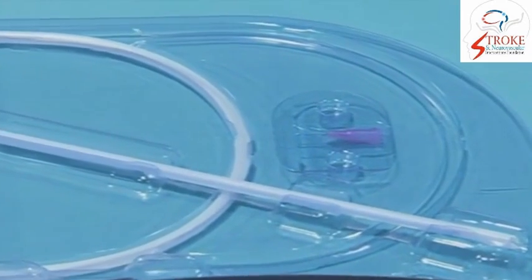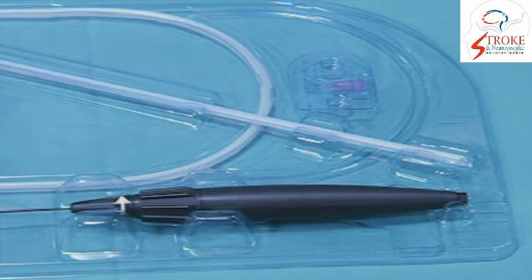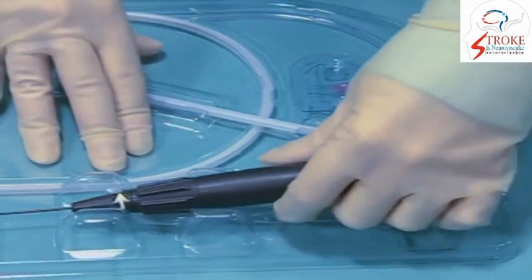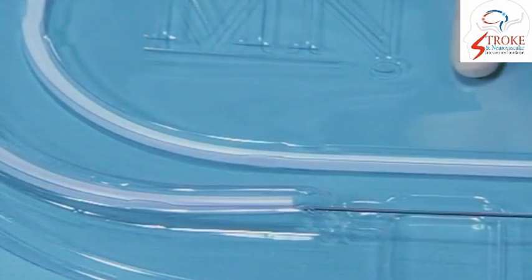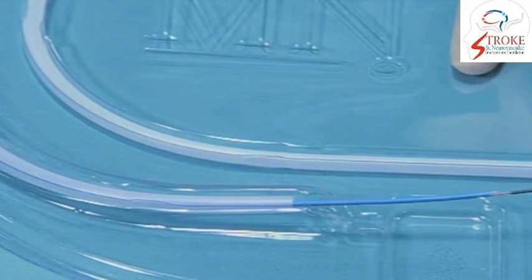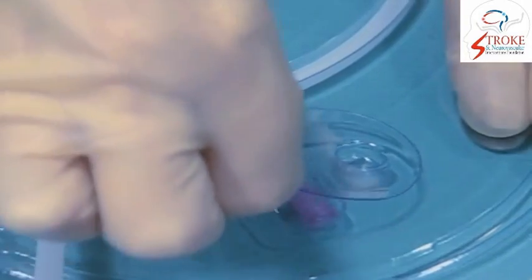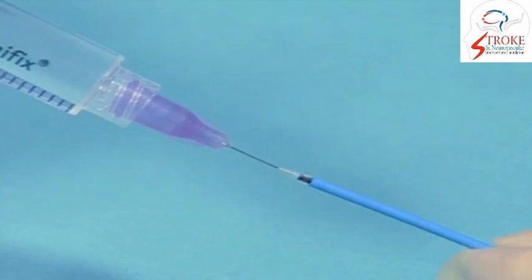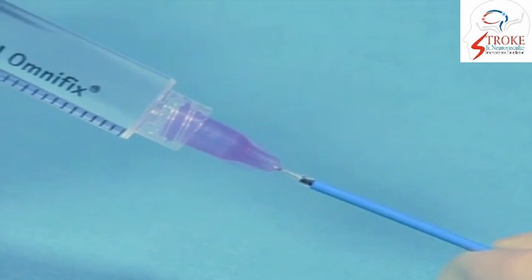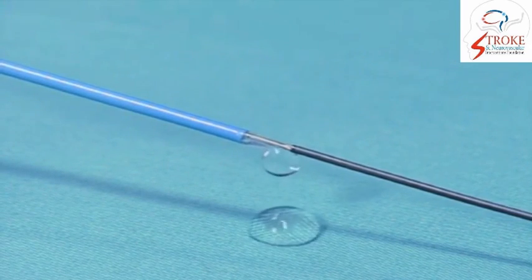The stent device will show you the steps in preparation of the stent. There is a very small needle which comes with the stent. So very carefully the stent is removed and then we flush the distal end of the stent using this very small needle which comes with the device. Heparinized saline is used and very carefully it is being flushed, and once you can see saline dripping out from this proximal port, we know it is done.